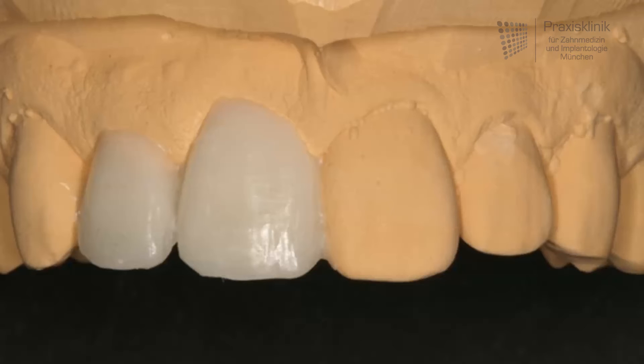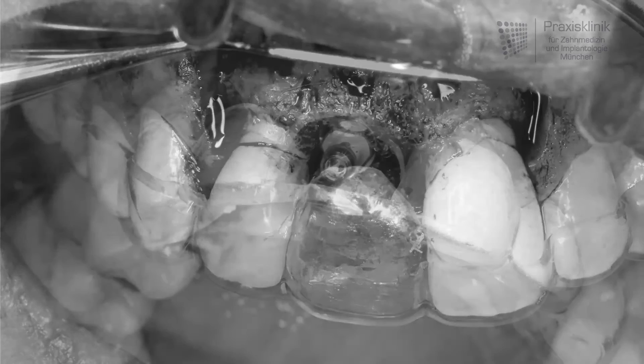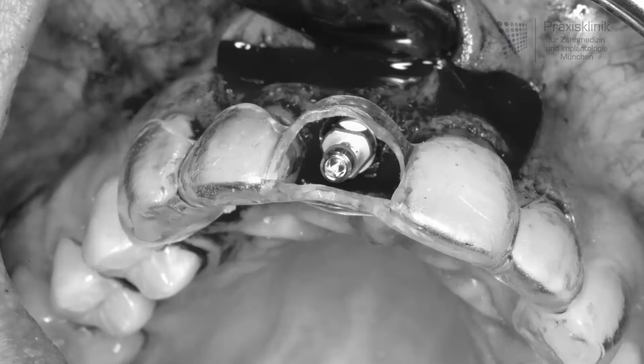In the next step we come to the surgical part. After the preparation of a mucosal flap and the exposure of the bone, a sterile template — a copy of the wax-up — shows us the position of the crown in relation to the jaw bone. After the preparation of the implant site by drilling a hole into the bone and the implant placement, the implant position can be surveyed by the template.